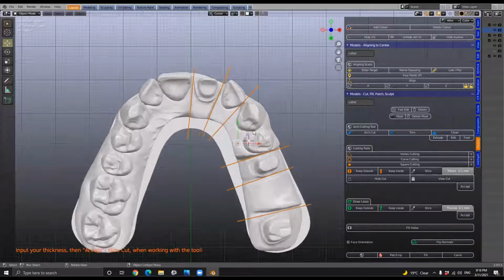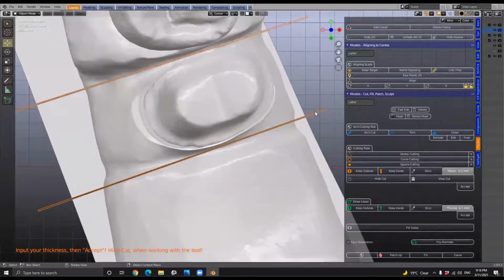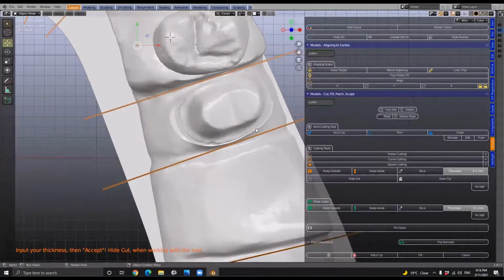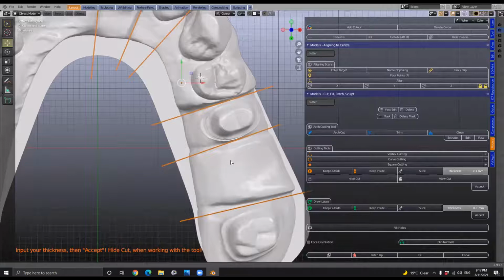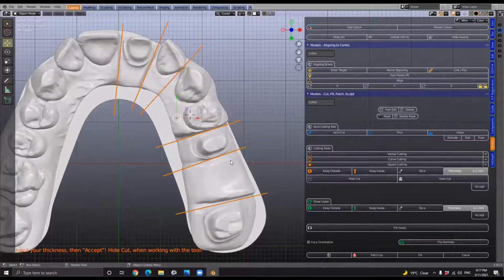Now, Wolfgang, can you explain to us the slices, how thick these slices should be? Yeah, so you can make the slices fairly thin, but the design of the system is we work with a burn layer to our advantage. And once Michael's done the slices, we'll show you how this works. So the dies are printed directly on the build plate. So we're using that burn layer for a clipping mechanism.